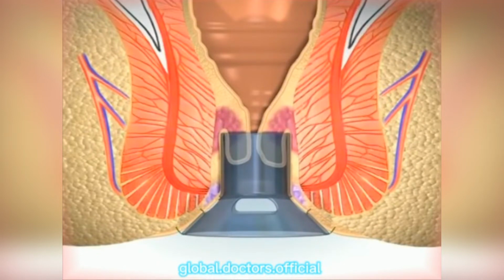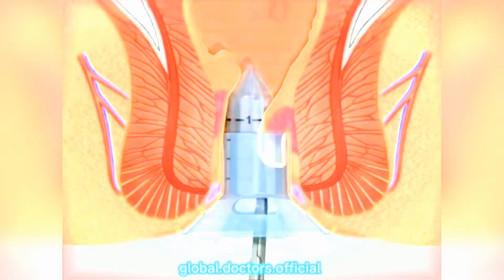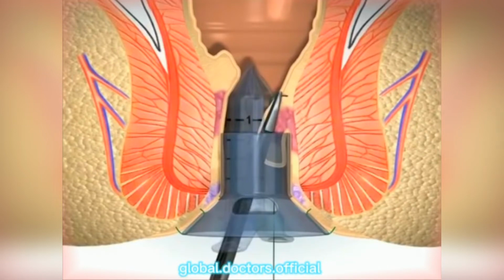The purse-string suture anoscope is inserted through the circular anal dilator, facilitating a circumferential purse-string suture of only the mucosa and the submucosa. The purse string is positioned near the tip of the anoscope. Use of 2-0 Prolene SH or Monocryl on a UR6 needle is recommended for the purse string.